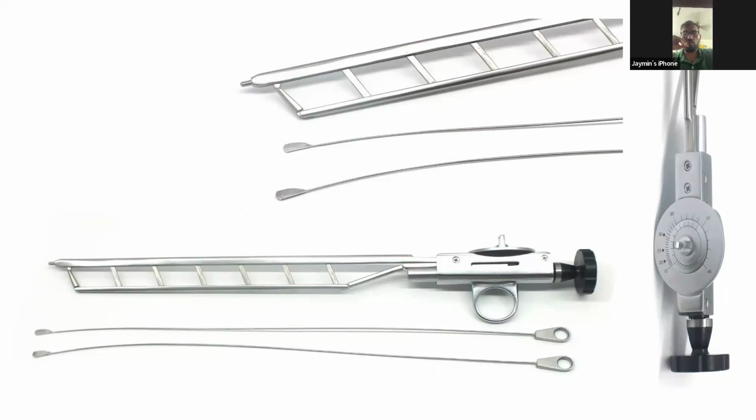The mechanism here is that the knife causes a linear cut on the urethral mucosa, sir, and so dilates according to the calibration which we have prefixed. So for basically transurethral resection procedures, depending upon the outer sheath size, we can decide the calibration which we want. So if you're going to use a 24 French sheath, then how much would you open the Otis Urethrotome to? 26 French, sir. 26, sir.